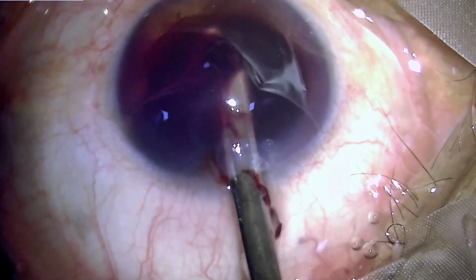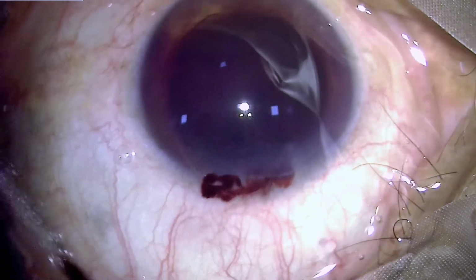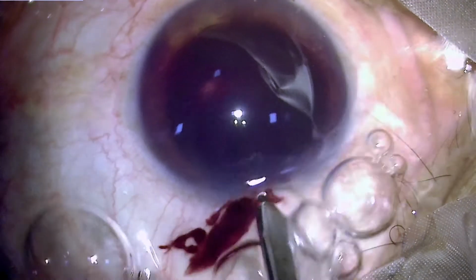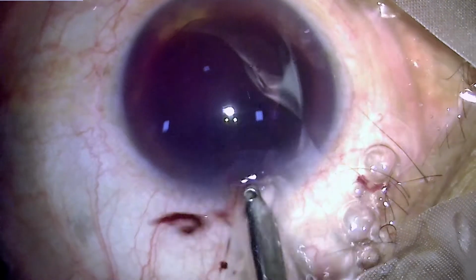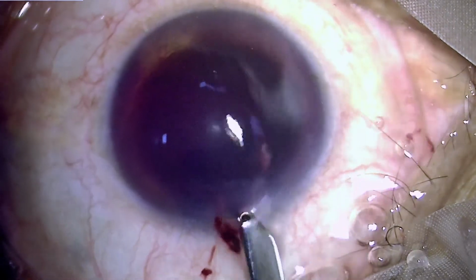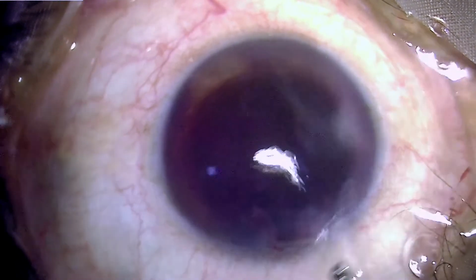We are using active aspiration created by a 5 ml syringe, and we are holding the clot and pulling it out, and it is apparent that it is coming out piecemeal just because the opening is small. But the advantage which this small opening provides is that the chamber is well maintained, which is so very important to prevent any occurrence of cataract in the crystalline lens, and also to protect the endothelium.